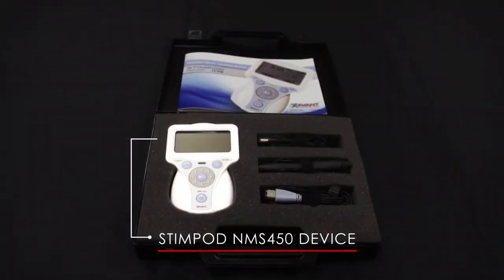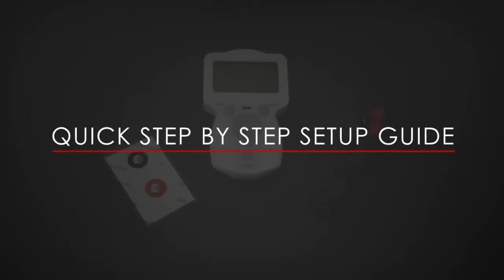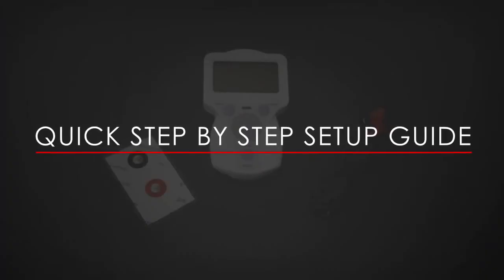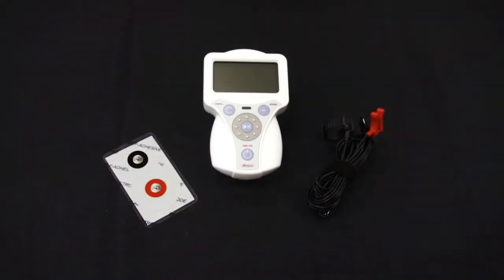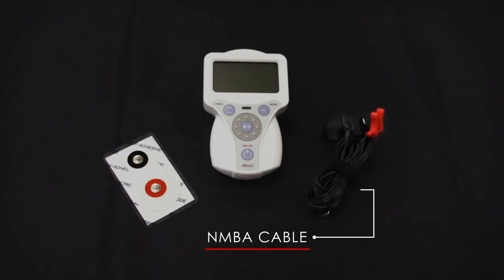The Stimpod NMS 450 kit consists of the following: the Stimpod NMS 450 device, locating cable, map locate cable, and NMBA cable. For this demonstration you will need the NMS 450, an NMBA electrode or standard ECG electrode, and NMBA cable.